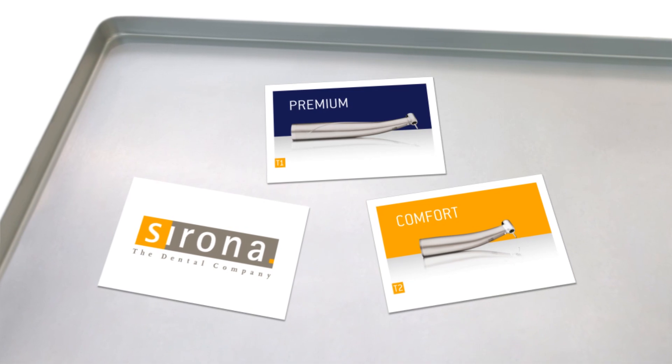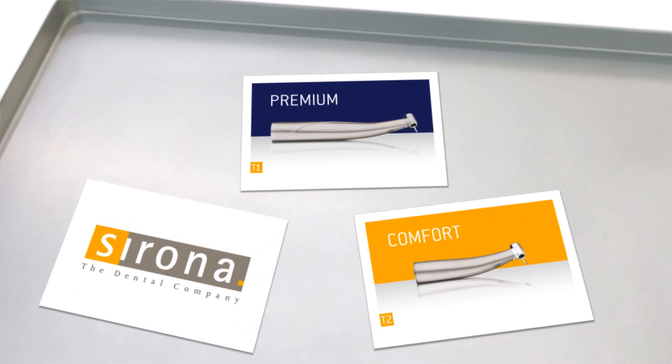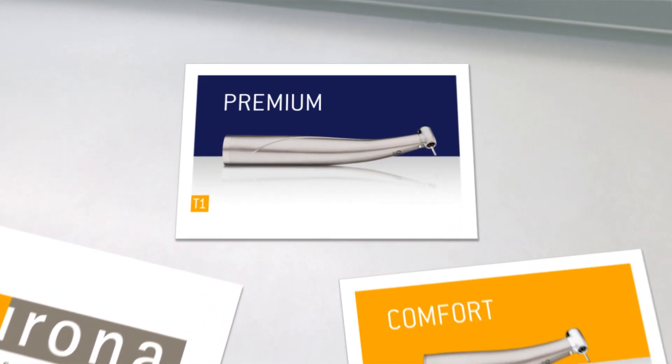Introducing Premium and Comfort, the new instrument classes from Sirona. Sirona Turbines — every class is unique.